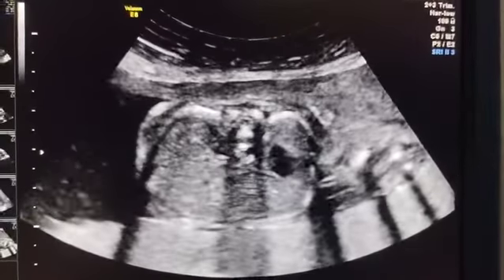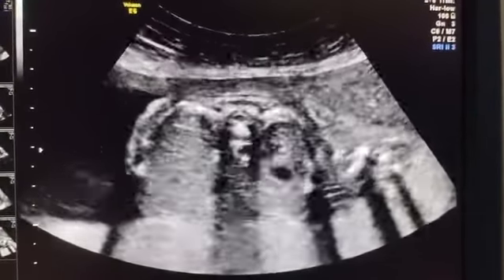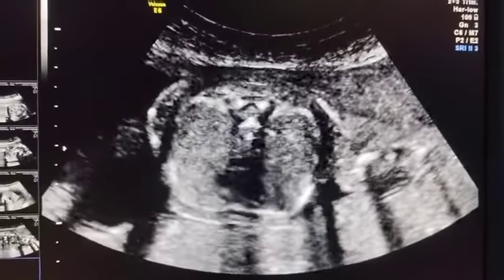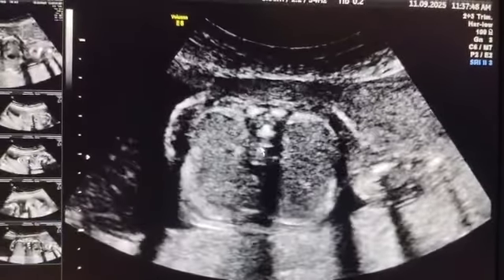Greetings, sir. This is for assessment of the fetal kidneys. As you can see, the fetus is in a prone position, which is very ideal for looking at the kidneys.